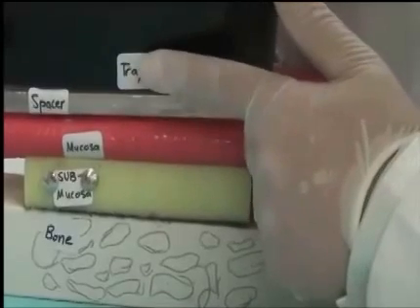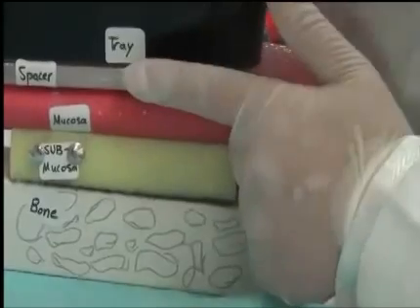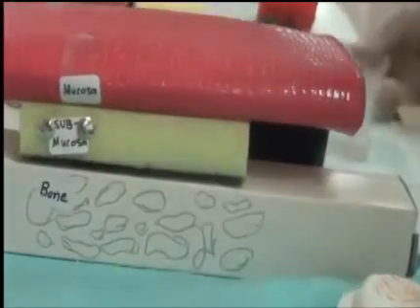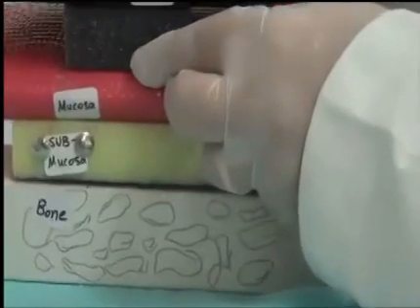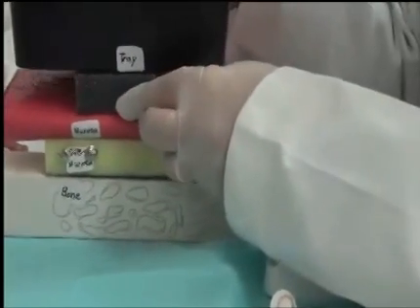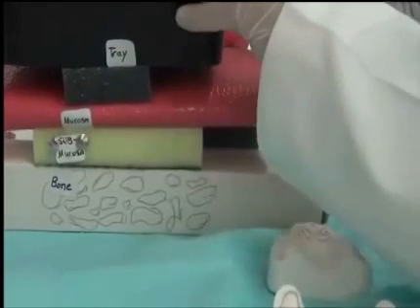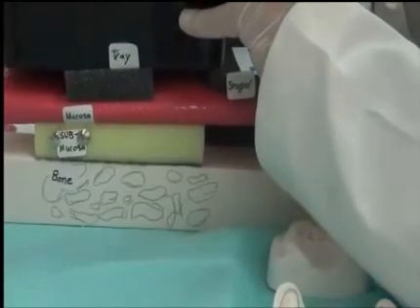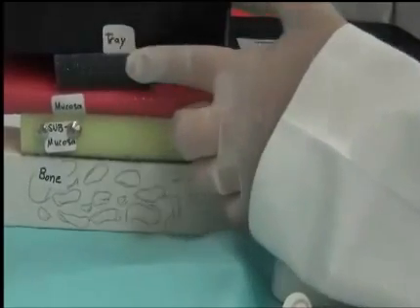We take our border molding, see that the tissue is not compressed, and once we're ready to put in our impression, we remove the spacer and the tray, put impression material in the tray, and begin squeezing. With the spacer preserving the space for impression material, we could not squeeze a lot, because we also have stoppers maintaining the space.